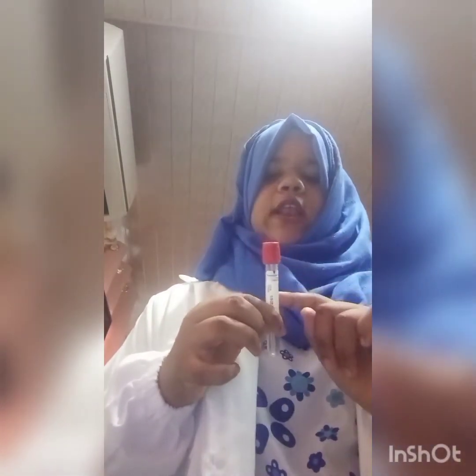The seventh type of vacutainer tube is the red glass tubes. The stopper color for this is red. The additive is none. Silica particles activate clotting. The department is chemistry, blood bank, and serology or immunology. In the hospital where I work, we usually take this red tube, which has no additives. We usually take this for biochemistry.